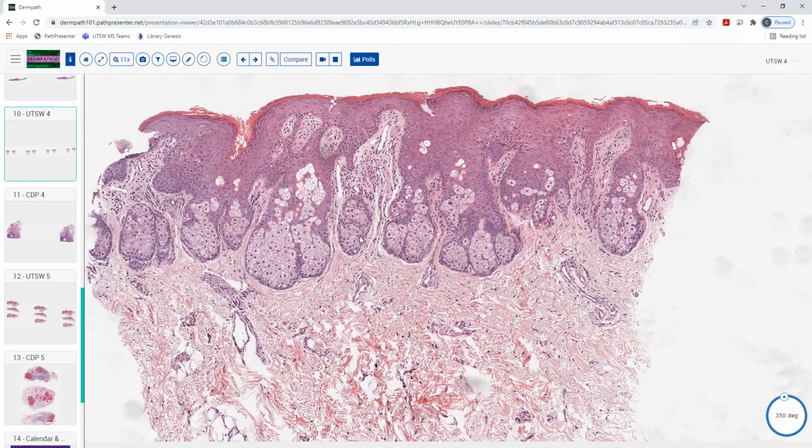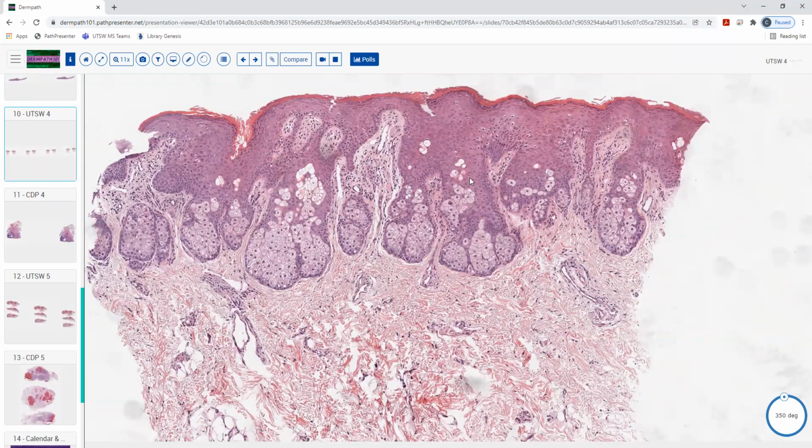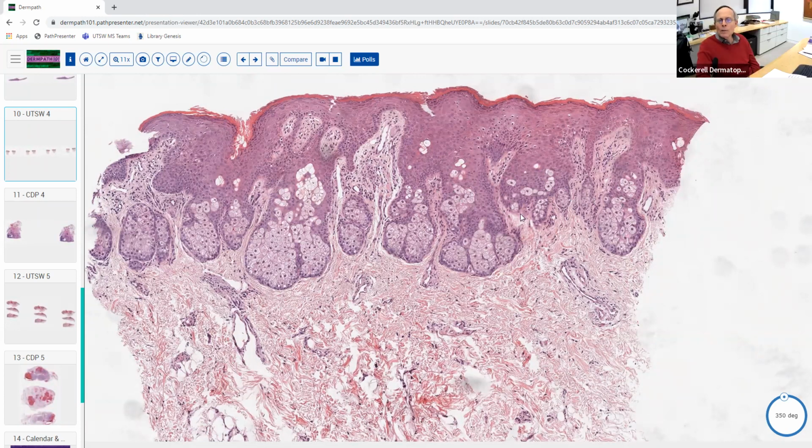I'm hoping it's not just actual sebaceous hyperplasia. That's in the differential. It's a little bit funny because it's got some involvement of these adnexal follicles here. So what if I told you this was a little yellowish bump inside somebody's lip, the vermilion of their lip, and maybe a little bit of it on the mucosal side of their lip?